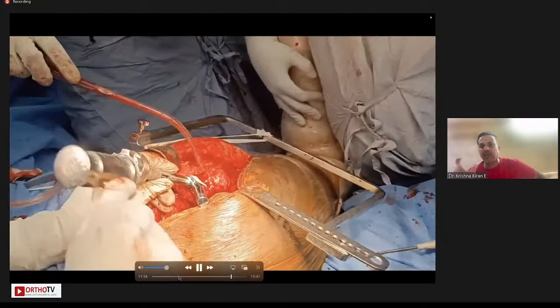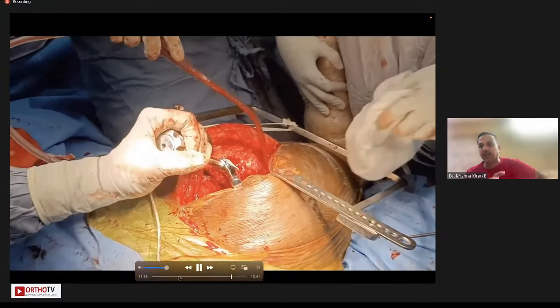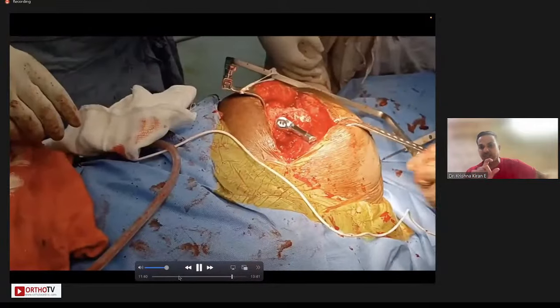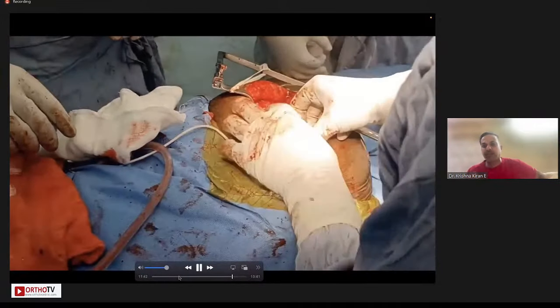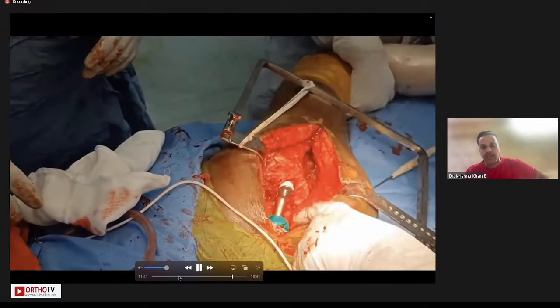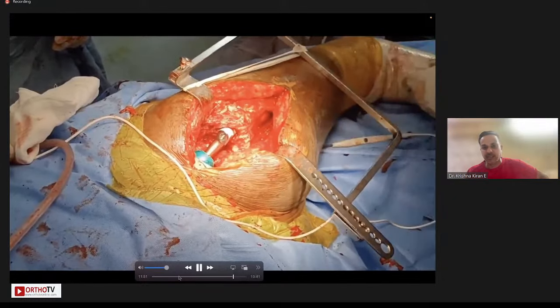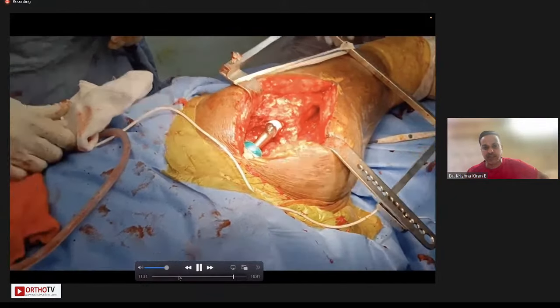So what we do, we get a provisional fit for the stem. We identify the reduction because it's a non-modular device. You need to have stable reduction, and then you keep on upsizing till you cannot engage your reamer with power beyond the reduction point on the shoulder reference, and that will be the correct size for that particular patient.